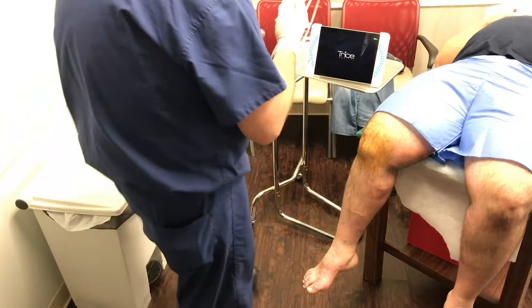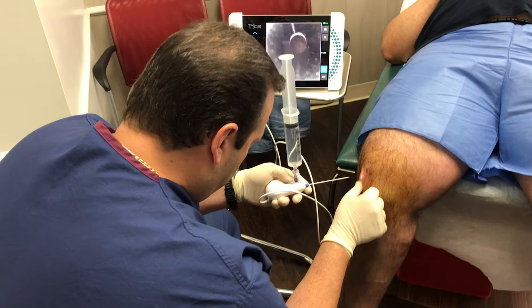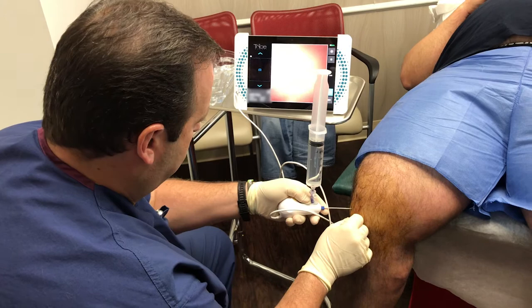Just relax, you'll feel touch, you'll feel some pressure. You really shouldn't feel any pain. You go back to work after this? No, actually — thank you for reminding me, I want to get a note. Can you have them write a note that says I was brutalized?